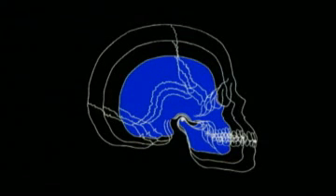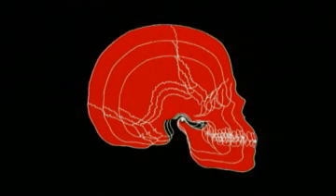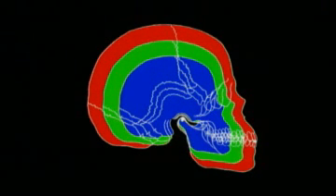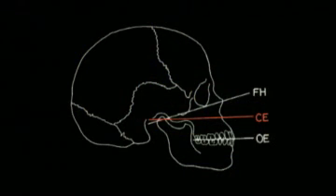It is a fact that there are smaller and larger jaws. Depending on the skull size of the individual patient, the individual Bonwell triangle may vary by up to approximately 50 millimeters. The UTS permits the transfer of the spatial position of the patient's Bonwell triangle to the joint components of the articulator. The UTS is suitable for model orientation according to Camper's plane, the Frankfurt horizontal, and the sagittal median plane.